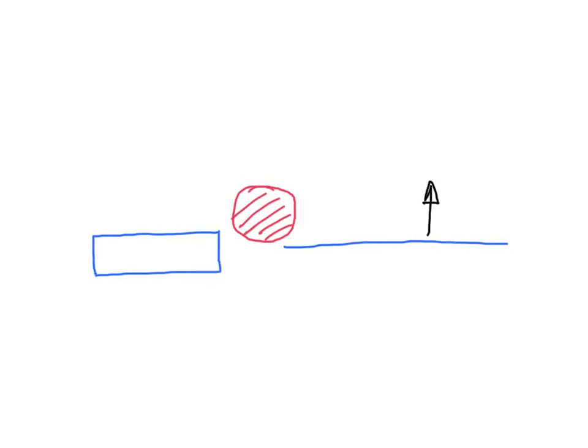Another way of doing it is we can rotate both the needle and the transducer using the lesion as the fulcrum, the center of the rotation point.